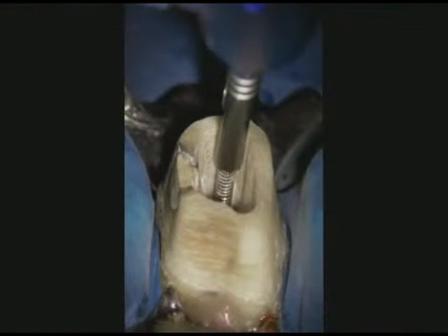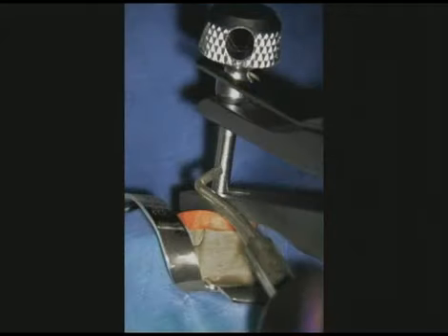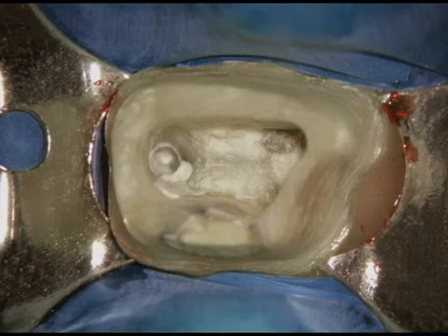A selected trephine precisely machines the coronal 2 to 3 millimeters of the post. The head of the post is perfectly round and can be tapped. This photograph shows the extracting plier mounted onto the engaged tap, the compressed rubber cushion protecting the tooth from the removal forces, and a previous version of the Endo 1 vibrating the engaged tap. These combined efforts result in post removal. Again, we can visualize the MB1 orifice, related groove, and a likely MB2 system.